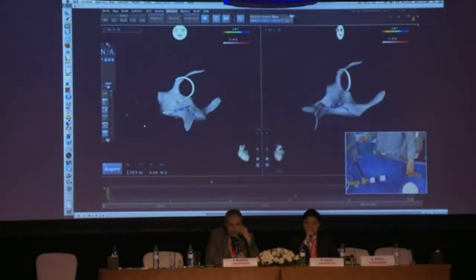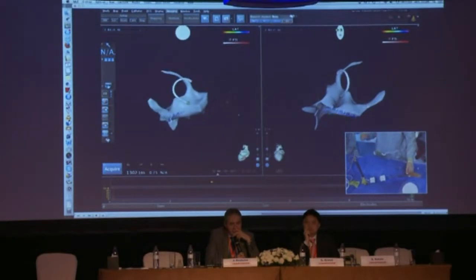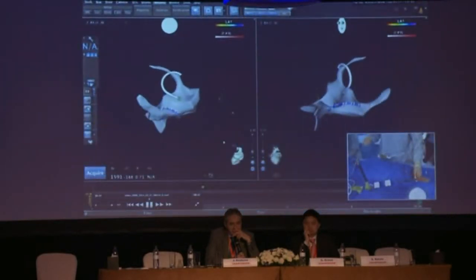Here we go. Here you can see me manipulating the decapolar catheter in the right atrium. The reason I recorded the geometry of the right atrium with the mapping catheter is it then creates a matrix so that you can see any catheter within the right atrium. So this is a barred decapolar catheter that I'm trying to get up the coronary sinus.